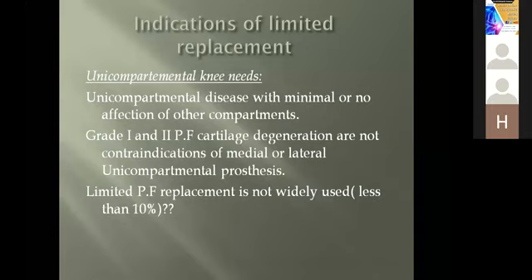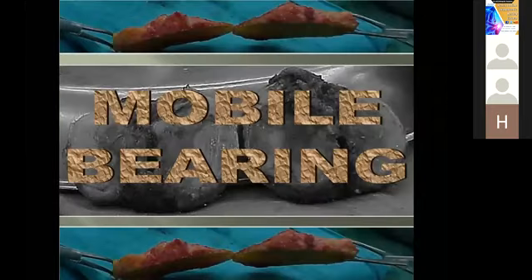Grade 1 or grade 2 patellofemoral cartilage degeneration are not contraindications of medial or lateral uni. Limited patellofemoral replacement, that's to say the patellofemoral arthroplasty, is not widely used, and worldwide it is less than 10% of all arthroplasty. The mobile bearing designs.